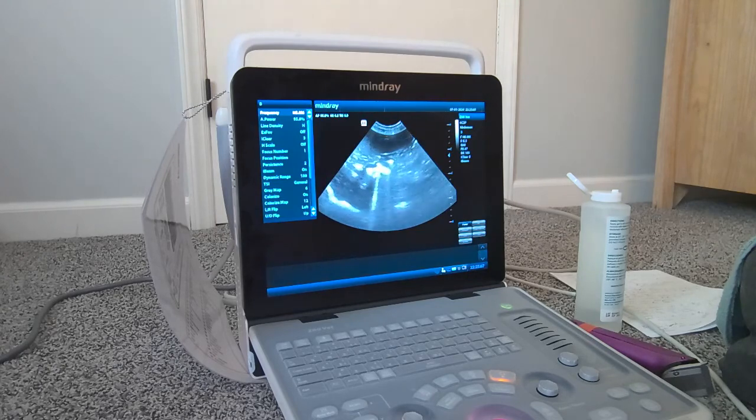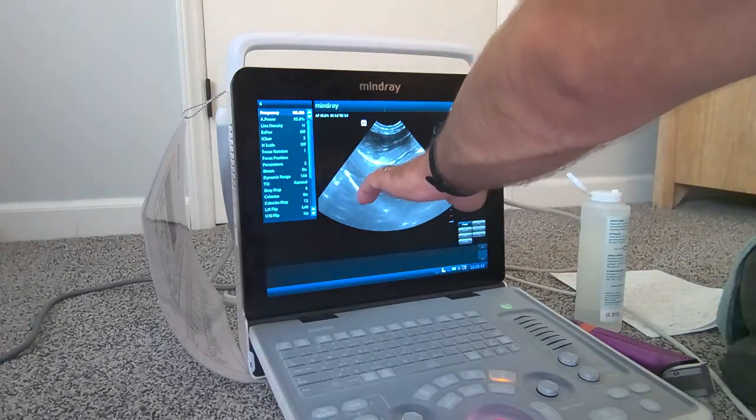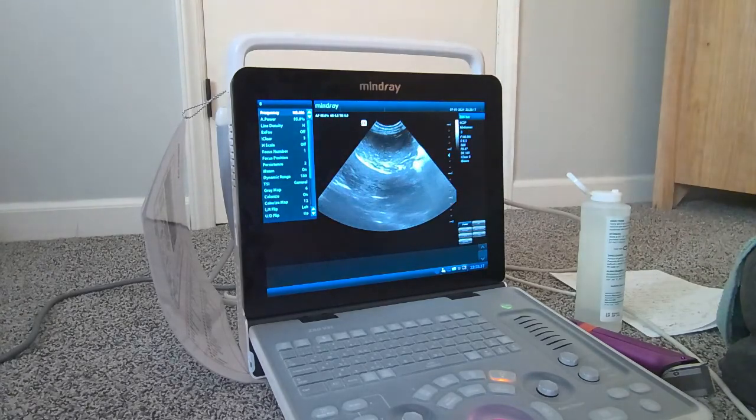Also, when you're looking at this side, I'm always comparing it to the liver, comparing it to the spleen right there, making sure I don't see anything. Sometimes it's hard, if there is a mass somewhere, to tell if it's coming from the liver or the spleen. But sometimes I'll look at the blood supply going through the two and see if they're continuous with the blood supply within the liver.